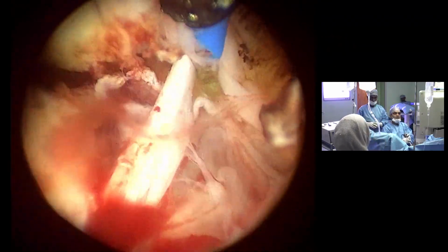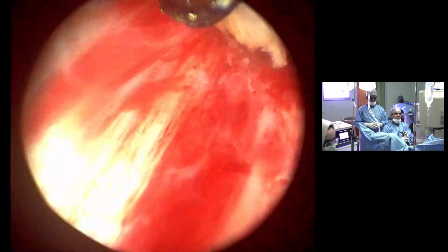So whenever there is a bleeding, you can reorientate yourself. Let the adenoma fall on the bleeding and take care of it for some time, and then you can restart. So that way, sometimes it may be helpful.